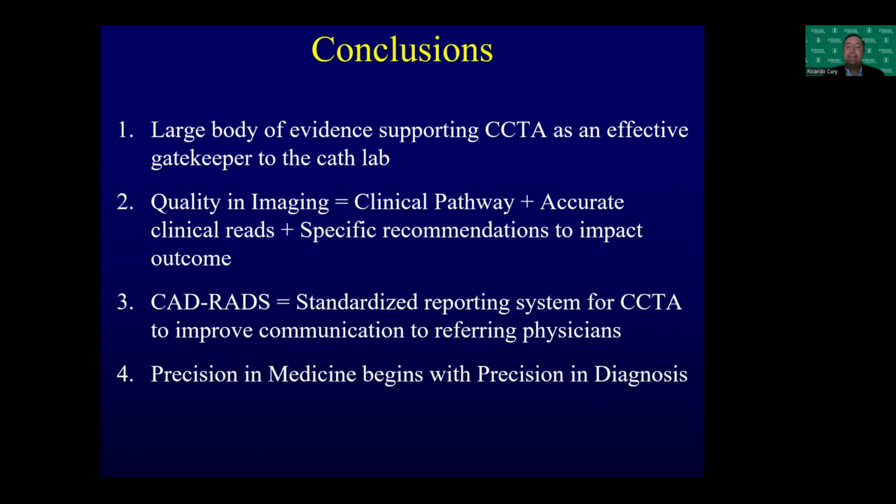It links clinical pathways with accurate reads and specific recommendations to impact outcome, very important. It led to a standardization of report for CCTA. And at the end of the day, precision medicine starts and begins with precision in diagnosis, and CAD-RADS is one more tool to be used in that regard.